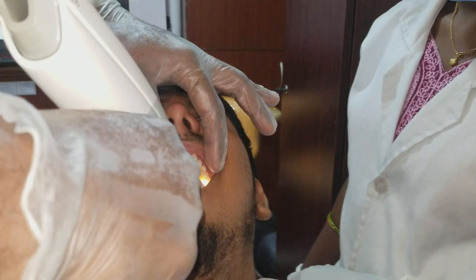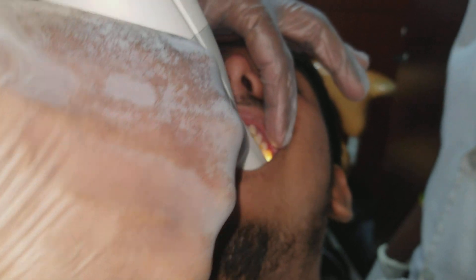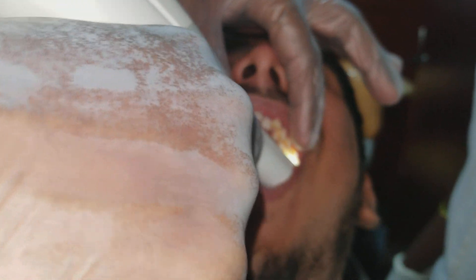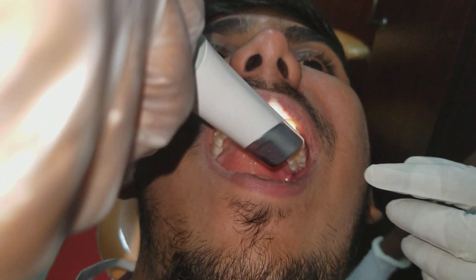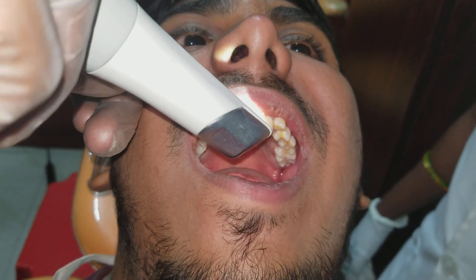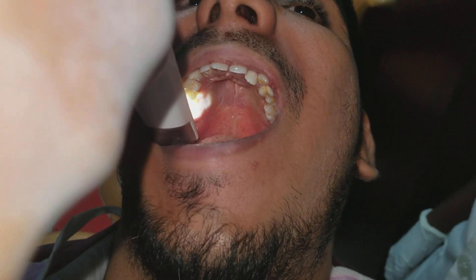It is like an optical fiber light. Once you take the biting side, we can proceed with this.